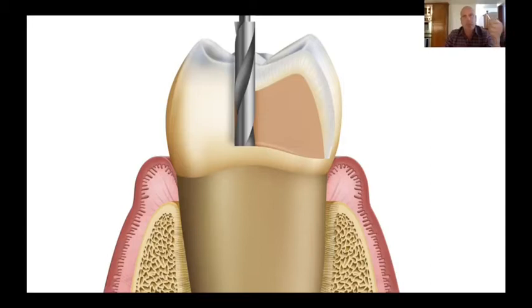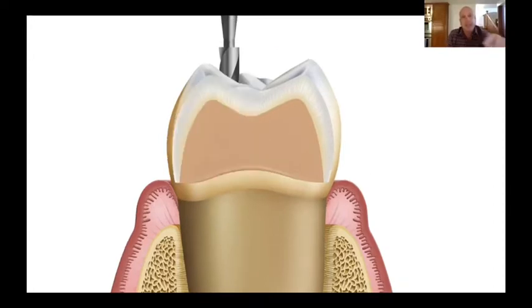The first thing we're going to do, like with just about any prep technique, is use a 56 carbide burr to break the contact — on the mesial and the distal. That's step one. And the reason we're breaking contact is for step two, which is we're going to place a retraction cord.